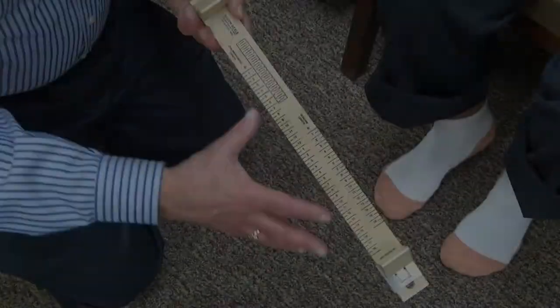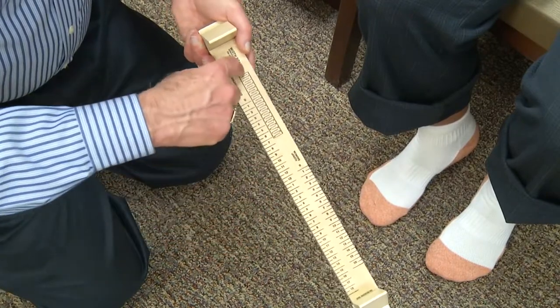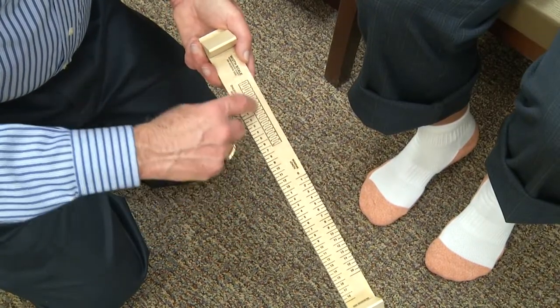I will now demonstrate how to properly use a RIT stick. As I said earlier, the Brannock device takes three measurements — heel to toe, heel to ball, and the width — while the RIT stick only measures heel to toe and width. When measuring a foot that may have a deformity, especially in the big toe that is curling over to the second toe, and you have to rely on a heel to toe measurement, you're going to measure short. The heel to ball measurement becomes the most important measurement to assure that you're going to fit a shoe properly by putting the widest part of the foot into the widest part of the shoe. On the RIT stick on the top, there are measurements for men's and women's lengths, as well as a rectangular box with the numbers you will use for the width.